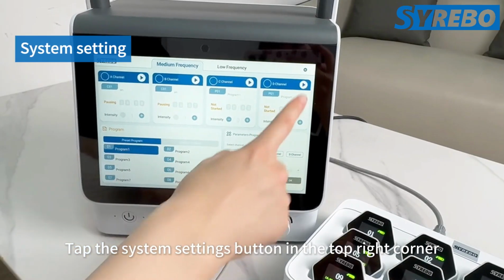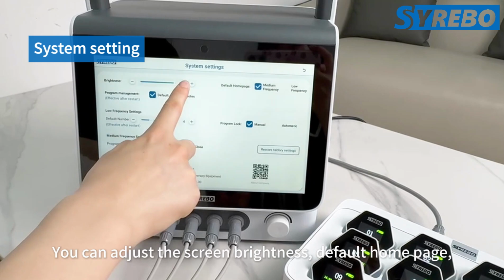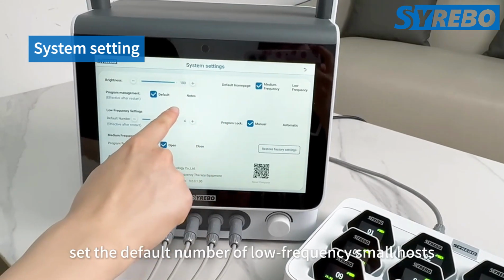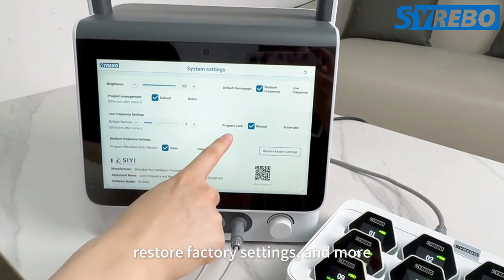Tap the System Settings button in the top right corner to enter the settings page. You can adjust the screen brightness, default home page, set the default number of low-frequency small hosts, restore factory settings, and more.